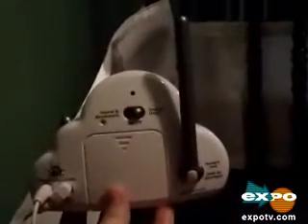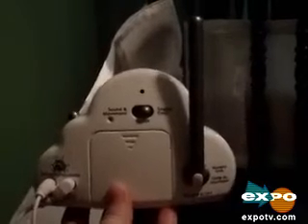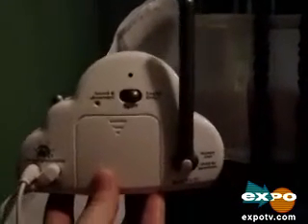This is what the monitoring unit looks like. You just plug this into the wall and plug it into the sensor that's under the mattress. There are different settings in the back here. The first is for sound and movement, so that you will have the alarm sound if movement stops.